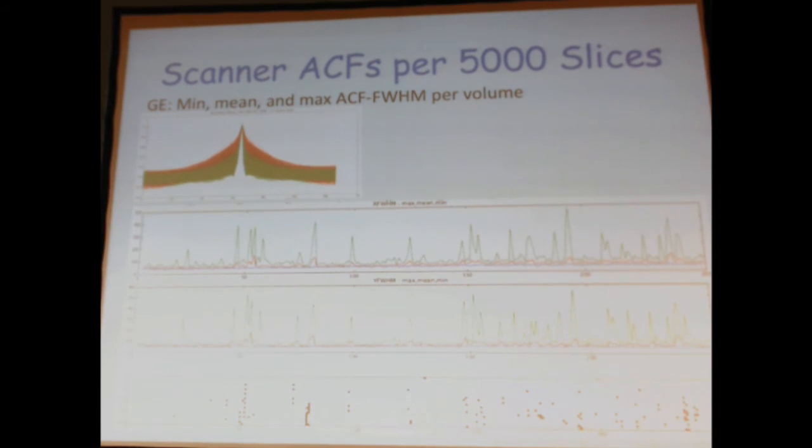So what you see is you go across the TR, and it's shown graphically down here where we put a threshold on this and then just put a black dot in the slice that goes above threshold. You can see the scanner goes in and out of some sort of stability which is being clearly seen in the full-width half max measure.